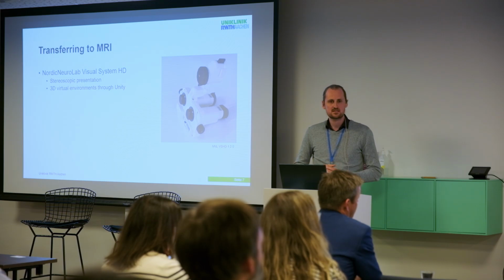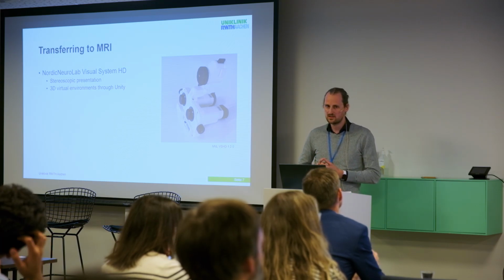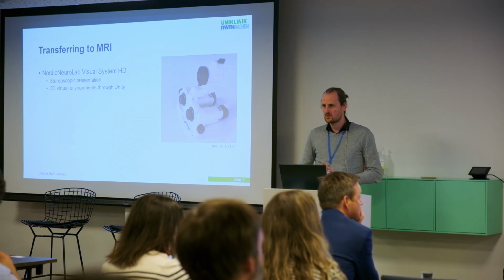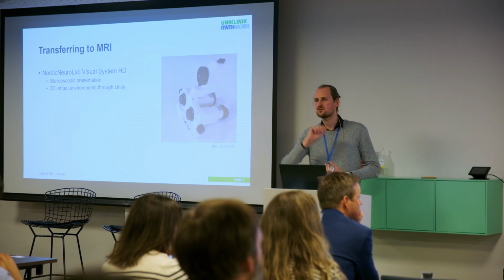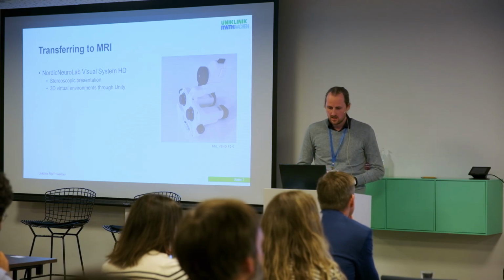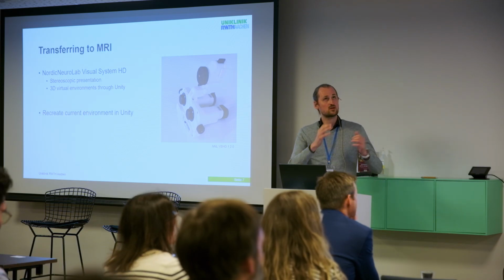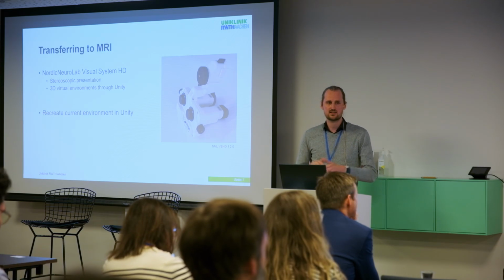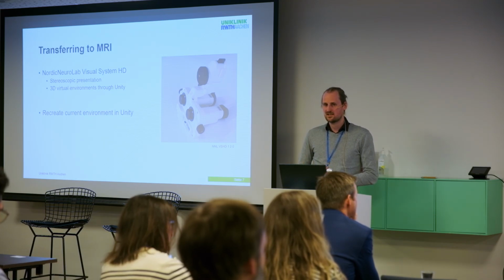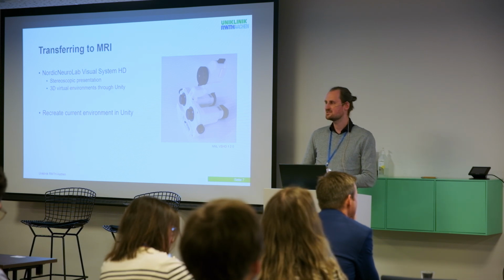The advantages of this, in our case, was mostly the ability to present stereoscopic stimuli, so we can generate this three-dimensional effect. And we happen to know from some previews, I think the one currently running there is also running through Unity, if I'm not mistaken. Yeah, so in theory, all we have to do is take our previously programmed task and transfer this to Unity. Aside from the engineers from NNL, I'm not sure whether anyone here has experience working in Unity.